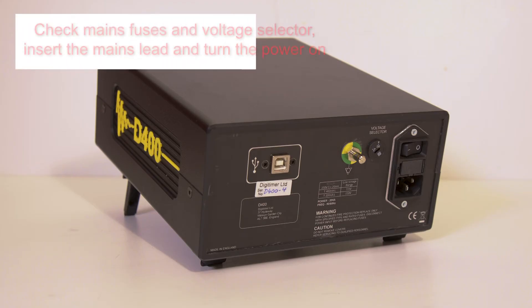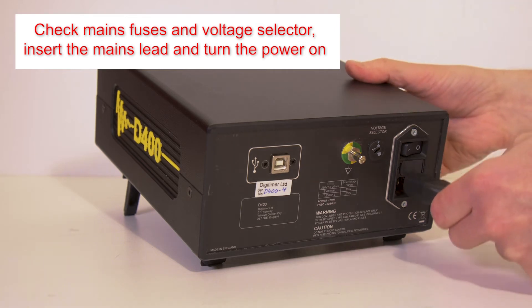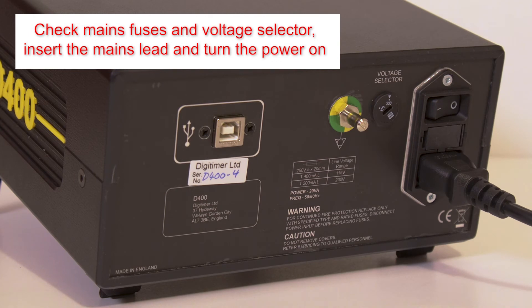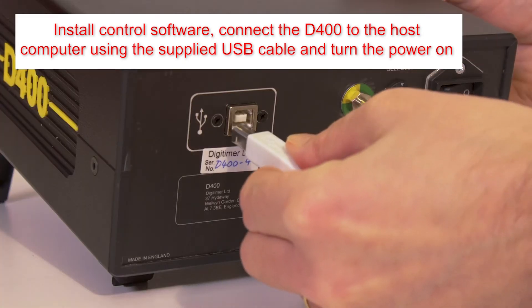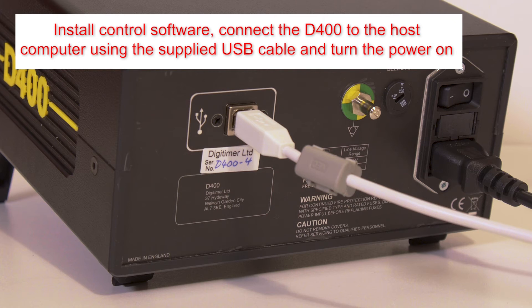Before use, please ensure the mains fuses and voltage selector are appropriately rated and set for your supply voltage, then insert the mains lead. If using a PC to control the D400 and having already installed the D400 control software, connect the supplied USB cable to the host computer and turn the power on.